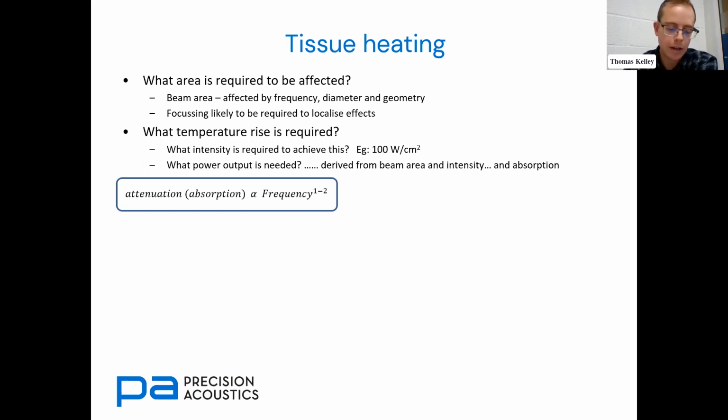But thinking along those lines gets us to a place that's close enough to begin thinking about transducer parameters. Really, for this sort of thing, there's some good benefits to be had with some FE modeling if it's a particularly complicated scenario. But that sort of thought process outlined here gets us going.